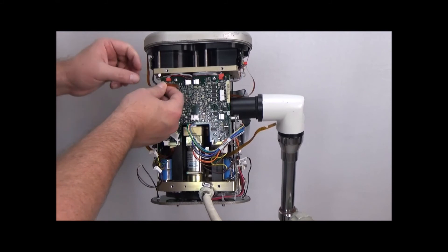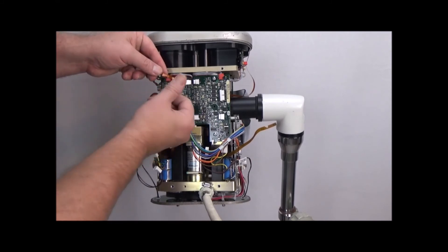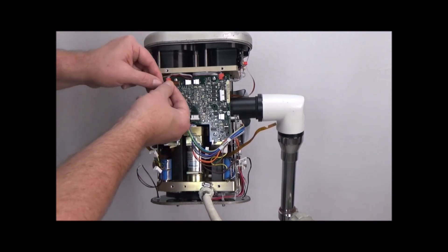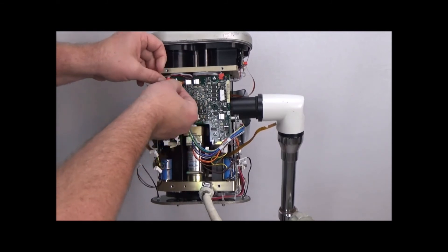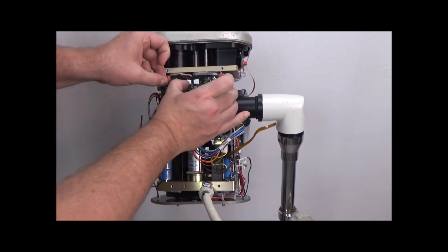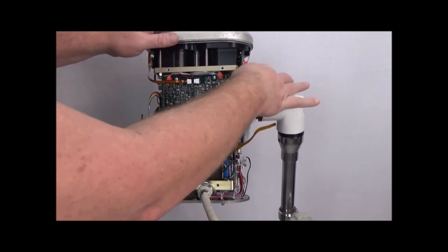Syringe sensor — shiny side out. There's a dull side and a shiny side; the shiny side comes up. Insert it into the slot all the way, then close it down.